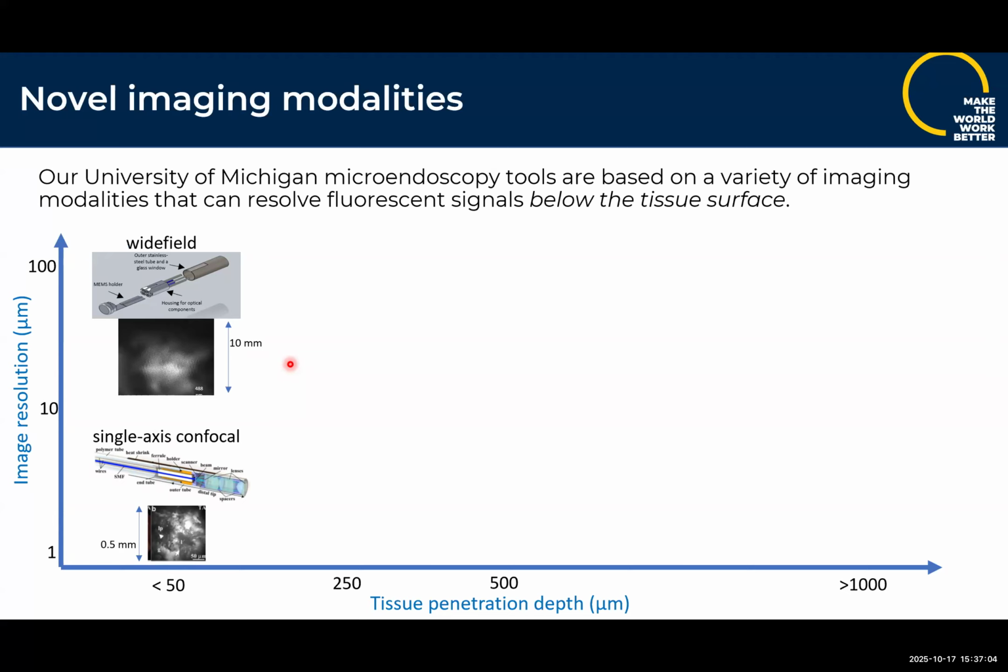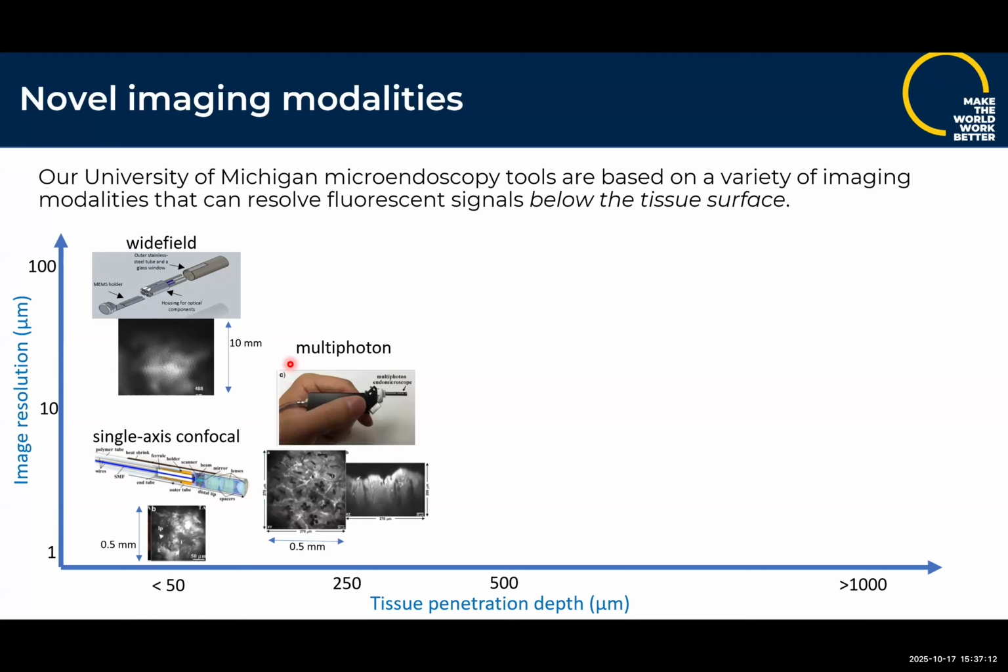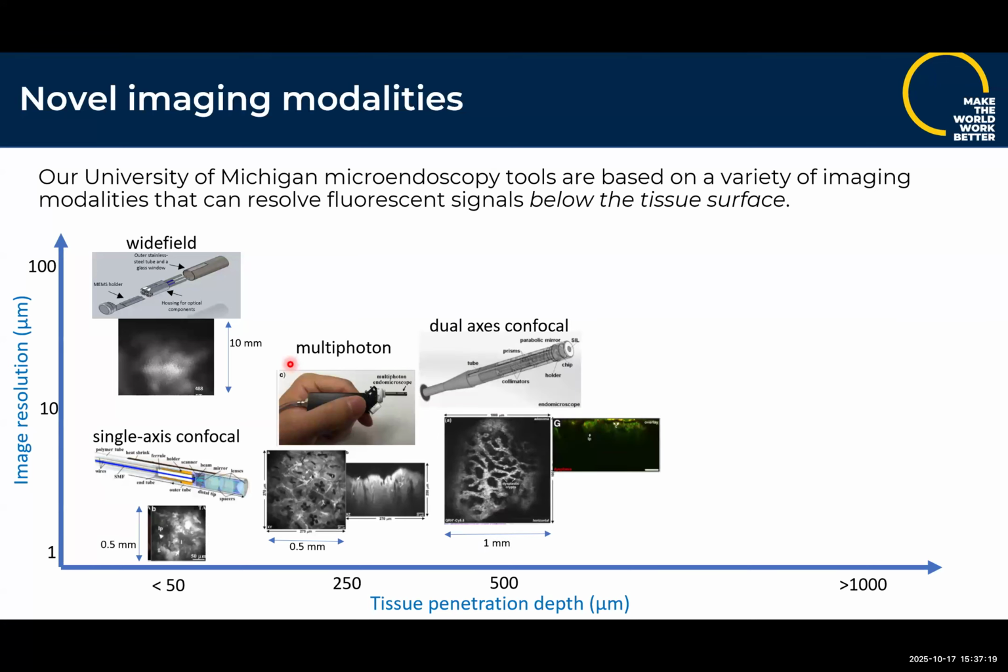of the internal organ. But the more novel designs developed in the imaging center are related to deeper into tissue imaging. Now, deep is not necessarily that deep. We do things like multiphoton imaging, it's called, or dual axis confocal imaging that are purely optical modalities that are capable of penetrating a few hundred microns, half a millimeter or so, into tissue and collecting fluorescence with sufficient rejection of scattered light to collect a usable image.